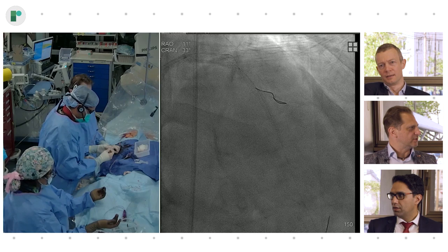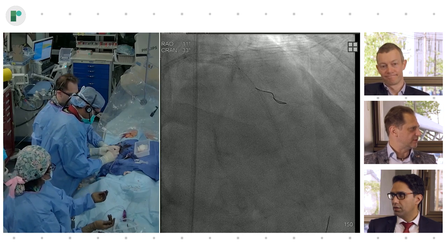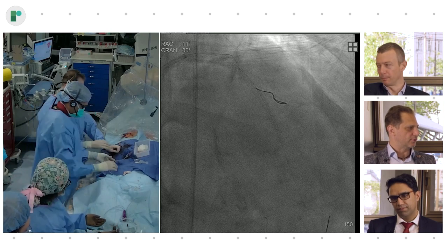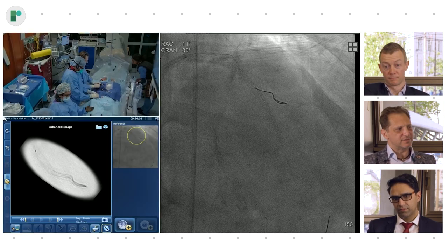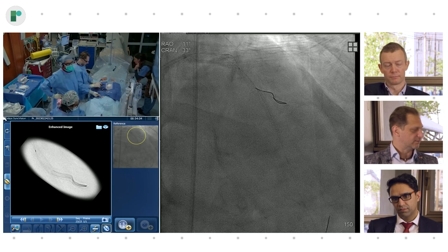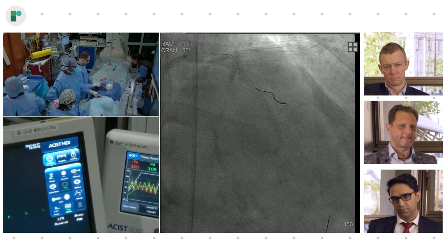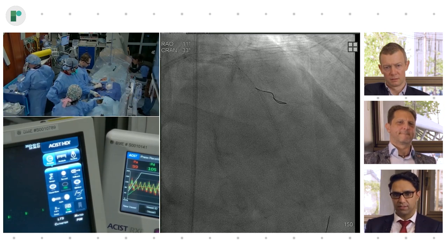Somehow we have a hesitation to use clopidogrel in a lot of, even in stable patients, and so if we use it, we want to make sure they're actually responders. Yeah, I mean, 20-30% are non-responders, right? I know, but the data is somewhat weak on testing in general. I know. But nevertheless, we do it pretty routinely. So here we're going back with the Navvus.